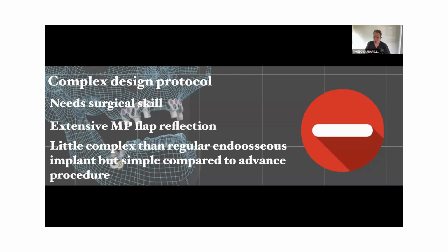And if we have the exposure, we can have different scenarios. If we have a small exposure without infection, we can keep the customized implant, just see the patient very often in order to check if we have some infection and keep the customized surface very clean. Or another option is to cut the part of the customized implant that is exposed, obviously if this part is not involved in the prosthetic part. If you have big exposure, big infection, sometimes we need to remove it.